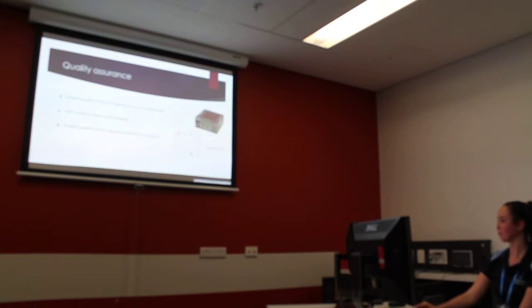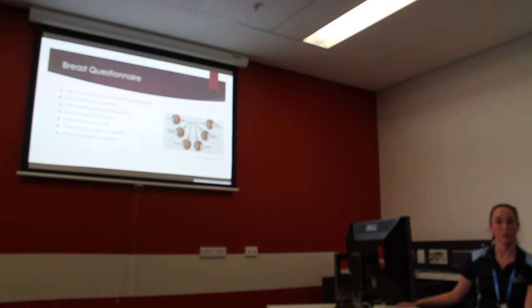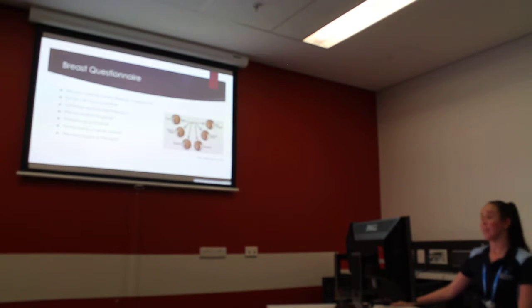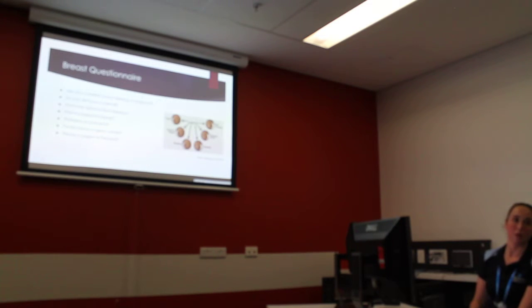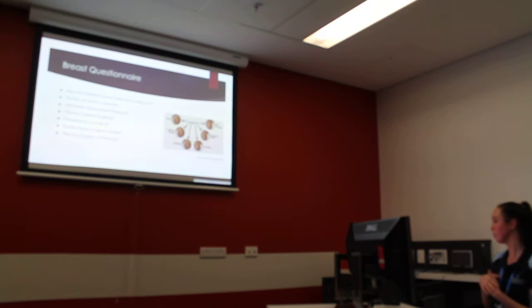to detect. So the breast questionnaire, this is asked with every patient and allows the radiographers and doctors to basically have a baseline and track the patients through any screening that they may have done. And it also helps us cater to the individual's needs. It's important that the patient stops breastfeeding 3 months prior to their mammogram. If not, full milk ducts may superimpose microcalcifications. We also ask about their menstrual cycle and recommend that they schedule it mid-cycle. So this is when they have high pain tolerance.